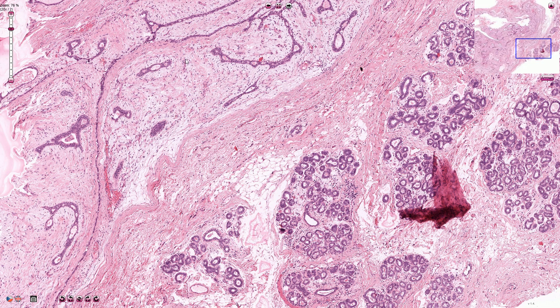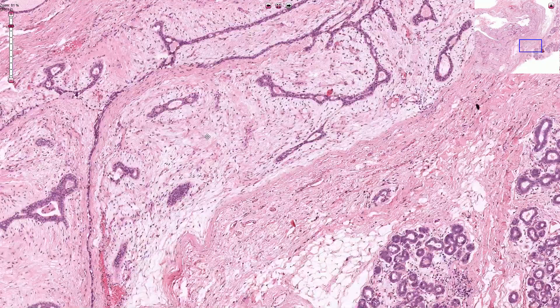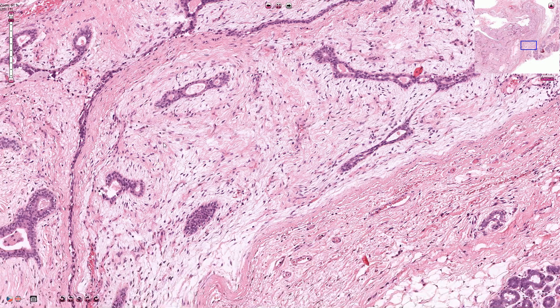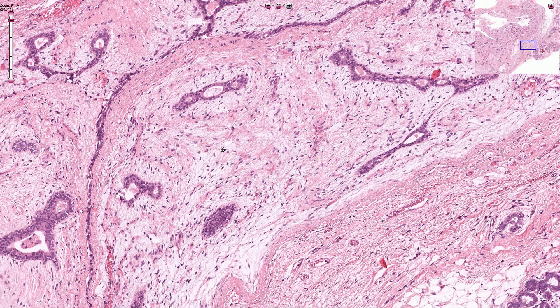Fibroadenoma has two components: the compressed epithelial ducts and the adjacent fibrous stroma. The fibrous stroma consists of collagen fibers and a cellular component, which are usually fibroblasts and myofibroblasts. The stroma is relatively hypocellular. The fibroblasts are bland and we should not see cytologic atypia, so we shouldn't see many mitotic figures or hypercellular areas.